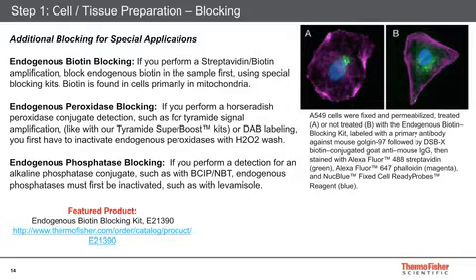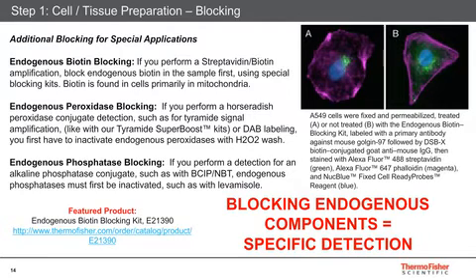And then also, if you use an enzymatic sort of detection, like with DAB or tyramide signal amplification, you want to block the endogenous enzymes in mainly tissue. For instance, peroxidases. If you're using horseradish peroxidase or HRP detection, like with diaminobenzidine on your tissue sections or with tyramides, you want to do a hydrogen peroxide wash to eradicate the endogenous peroxidases before you go through with your labeling. Phosphatases also, like for BCIP/NBT detection, you want to reduce the endogenous phosphatases with levamisole. Always, to get a specific detection.